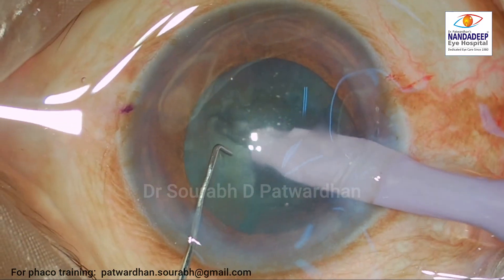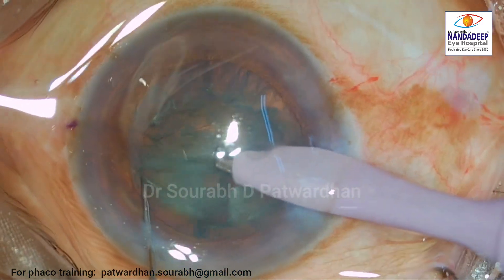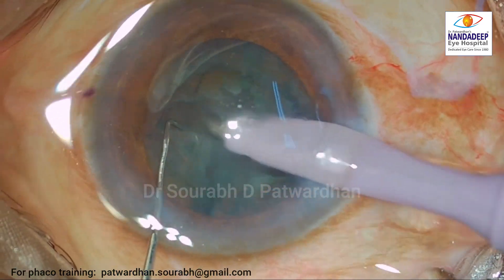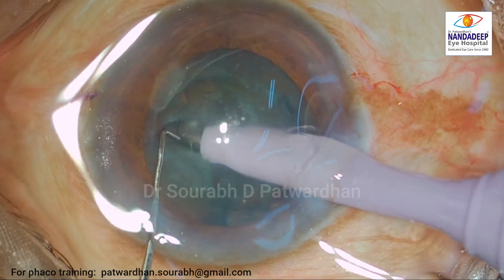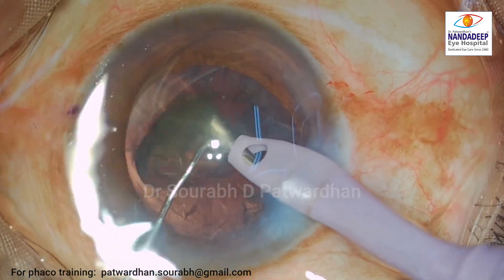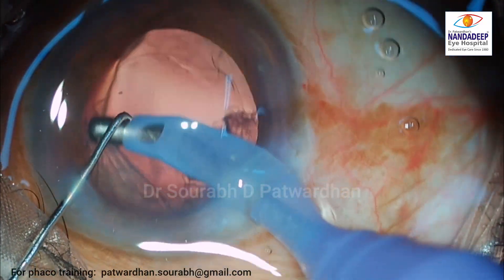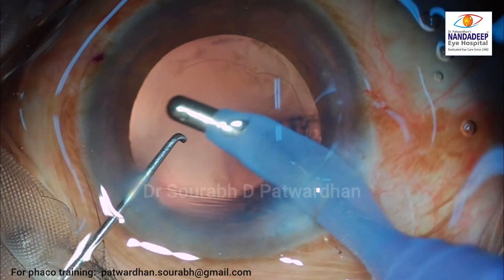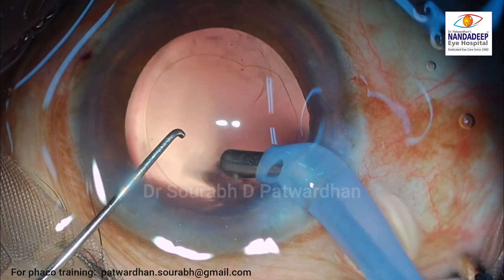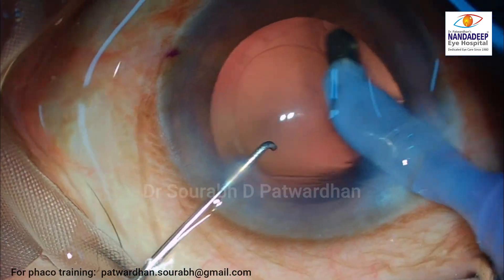This is a routine cataract case with no specific high risk for developing a posterior capsular rupture. The phacoemulsification was carried out uneventfully. So far it had been uneventful, and then while polishing the posterior capsule, I suddenly realized that the posterior capsule was torn.